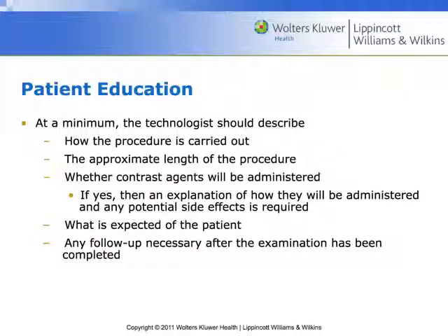Patient should be told, okay, this is how this thing works. You're going to lay on this table, you're going to move through the donut. You're going to get a warm feeling, you're going to feel like you wet your pants, and then we're done. Right? That's basically how the procedure is carried out. It's going to take me about 10, 15 minutes. I'll say, even though I can do it in about 5 minutes, I'll say 15 minutes, because then when I'm done in 7 minutes, they'll say, man, you're fast. Right?